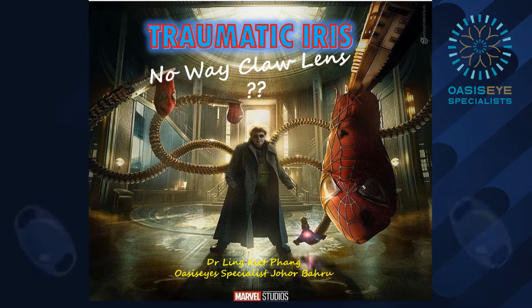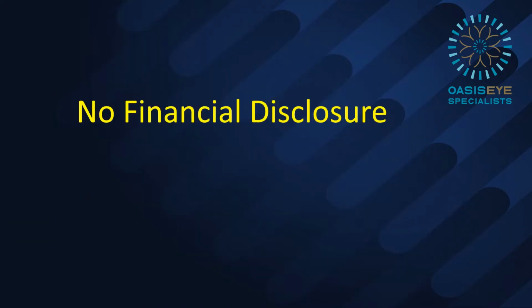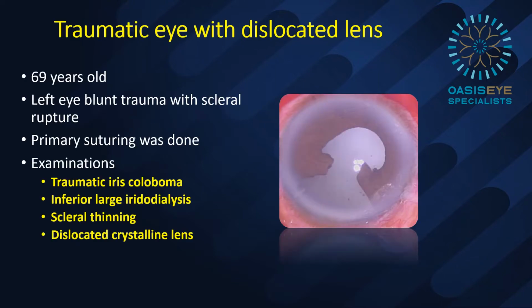This video demonstrates a repair of traumatic iridodialysis, simultaneous retropupillary iris claw intraocular lens implantation. This patient was referred post-blunt trauma with dislocated lens. He is a 69 years old, has had a primary sclera suturing for last circumferential sclera laceration near the limbus.